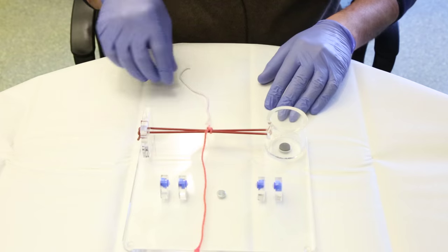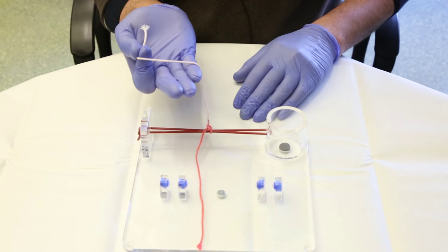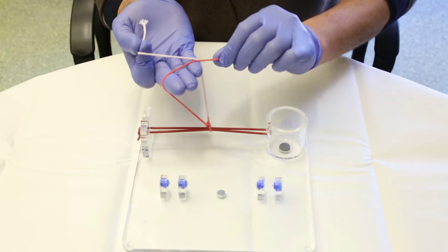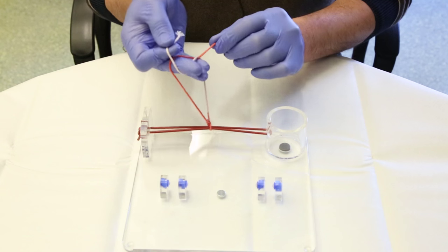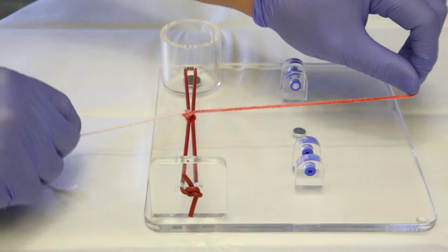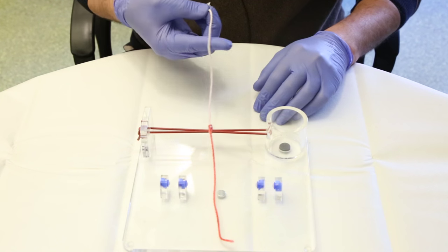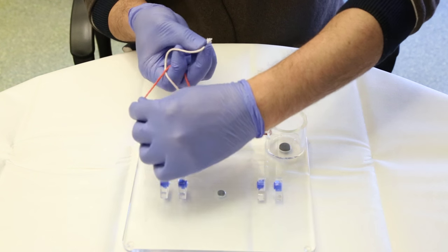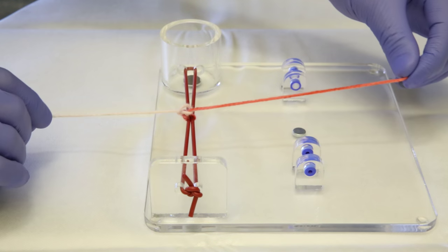To repeat: first knot — thread on thumb and index, rest of the thread in front of the other fingers, bring the other end from the opposite side forming the loop, cross the finger between the two ties, take it inside the loop, and make the knot. Opposite knot — thread with thumb and middle finger around the index finger, bring the other end from the opposite side, cross the finger, take the thread inside the loop, and form the knot.